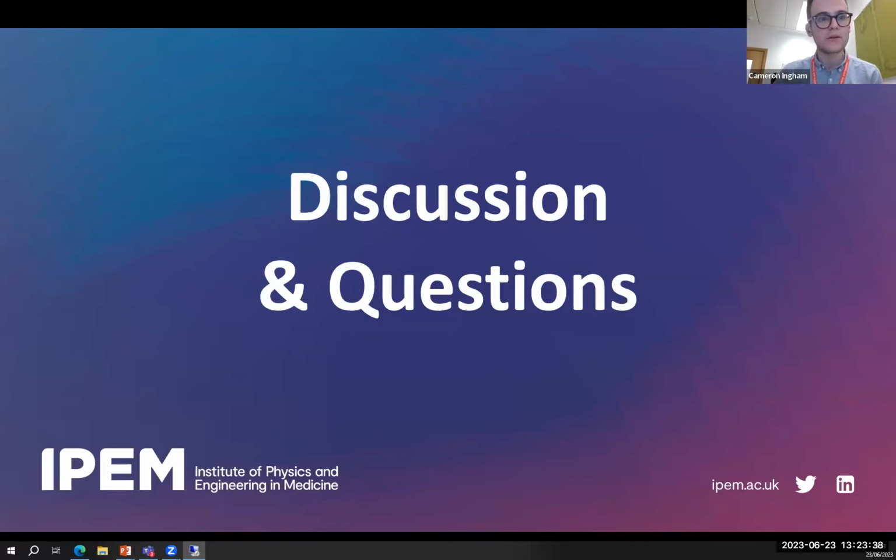Thank you. Okay. Brilliant. So I'll group a couple of questions about DR Swift Brain. Simon, I've got a question on whether DR Swift Brain will run in other orientations or whether it's locked to the orientation of the protocol set, I assume. I suspect it's not going to be locked. The way auto align works is it picks up which way you've orientated it. I've not checked on the Swift Brain, but that's my knowledge of auto align.